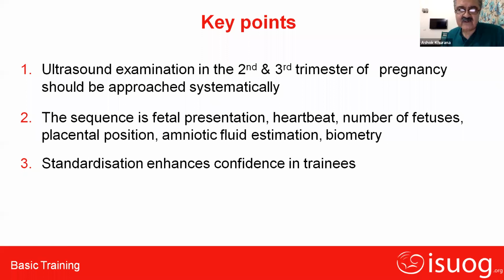excellent way for confirming the presence of a corpus callosum. Of course, very occasionally there can be exceptions, but in general, if you see a good cavum septum pellucidum, you will always see a good corpus callosum. No doubt about that. And I think holoprosencephaly can be excluded right in first trimester itself, if we don't see a midline falx, then it is a holoprosencephaly.